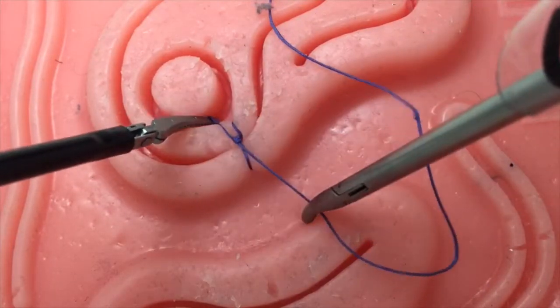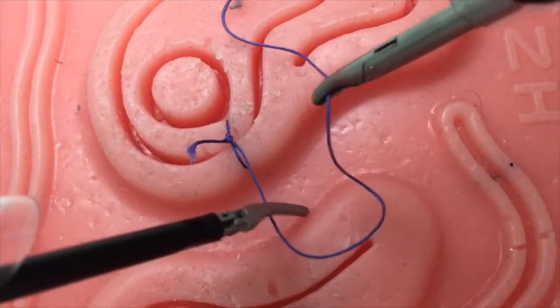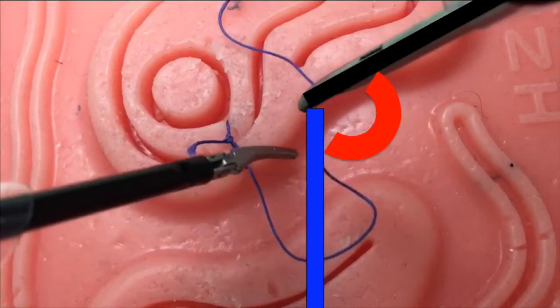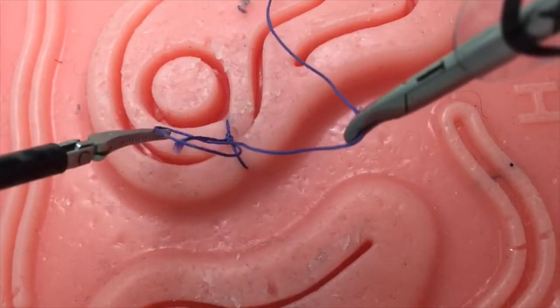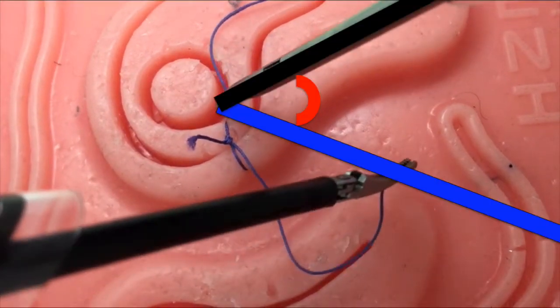On this last throw, the elongated U is again created and the instrument is placed inside the U. But due to this large instrument to suture angle, the loop slipped. Efforts must be made to minimize the instrument to suture angle in order to tie with ease.